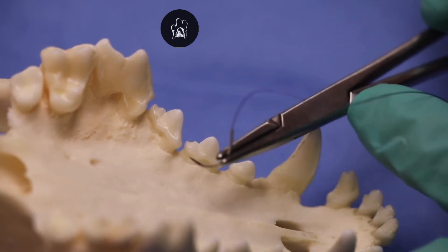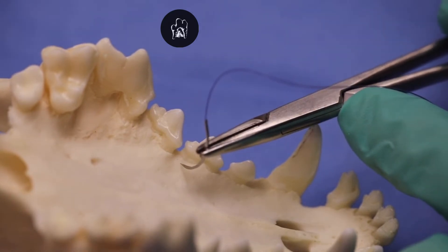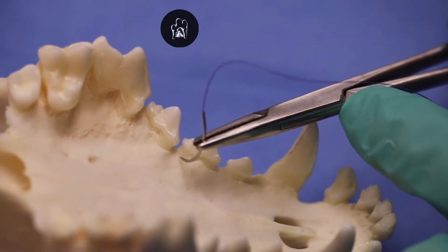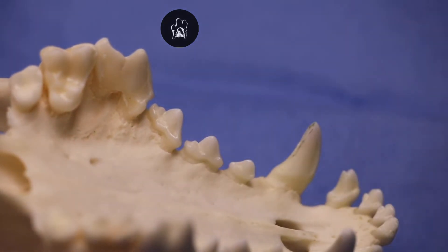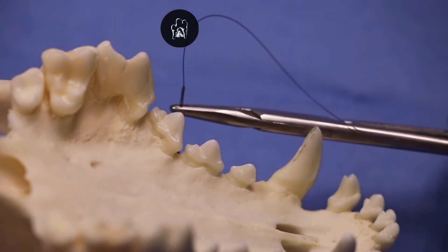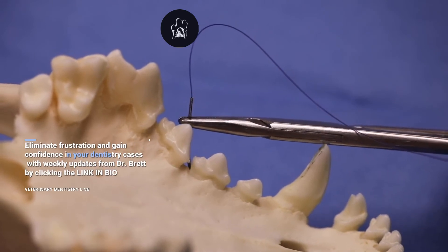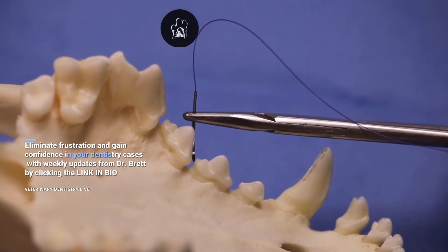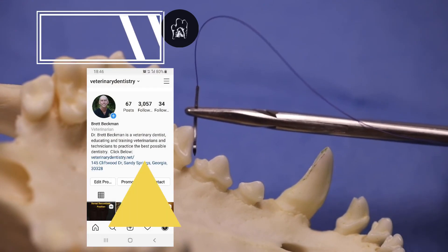So if we place that needle on the palatal mucosa a millimeter or so on the palatal side and pass it through — or we can also go from the vestibular side to the palatal side as well — just passing it through and underneath the crown of the tooth, we can very easily engage the other side of that mucosa and make that interdental incision closure very simple.